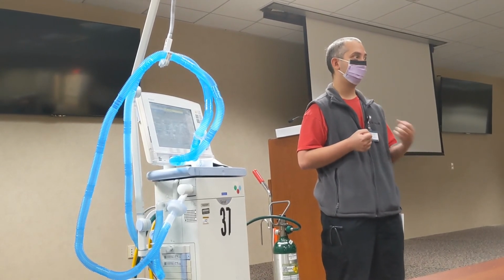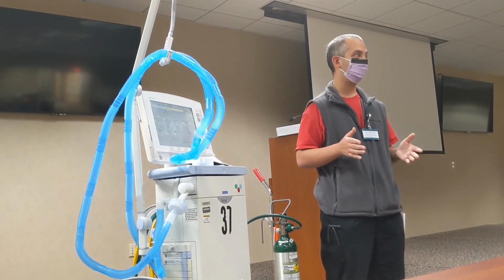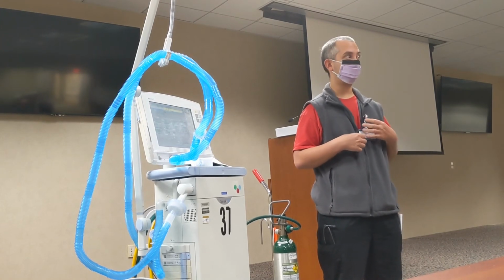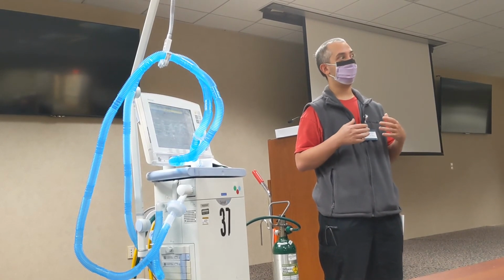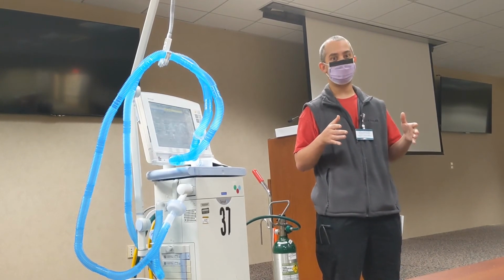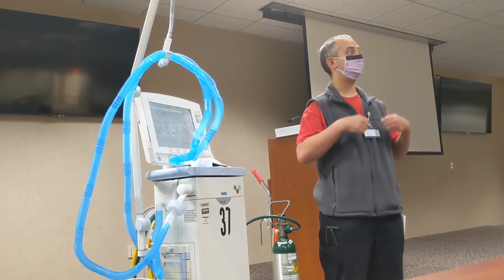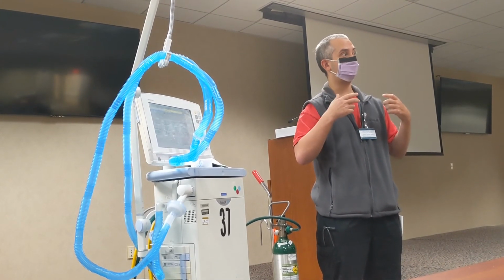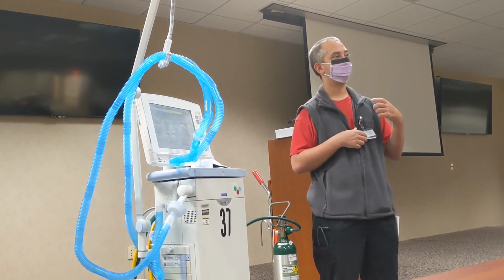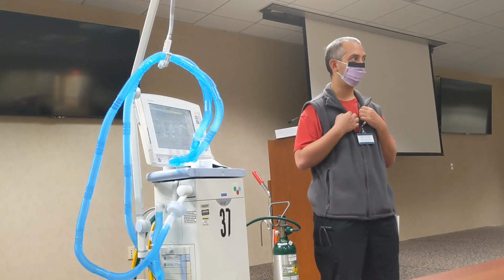If they're deeply sedated or paralyzed, you are responsible for all of their ventilation. When they're a little bit more awake and taking some breaths on their own, then that's when you can start stretching some of your T high out a little bit, because they're doing some extra ventilation on top of what you're giving them. And so that helps with the weaning process a little bit more.